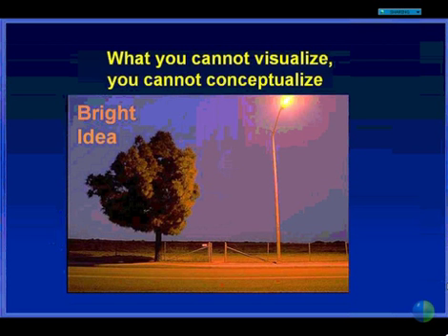So we've compared a series of cases with a TopCon static ICG after having already imaged them with a Heidelberg dynamic ICG. So we actually knew where we were expected to find the feeder vessels. And on a series of 6 cases, I could only reliably identify it with static ICG on maybe 1, perhaps 2 cases. And that was only after I knew where to look. The problem with static ICG is you're only acquiring about 1 image every 2 seconds. And it's very easy to miss the key transit phase that you would identify when you're capturing 8 to 12 images per second with a video ICG. So generally, no, you can't. As much as I wanted to try to confirm that static ICG could do this, it does not.